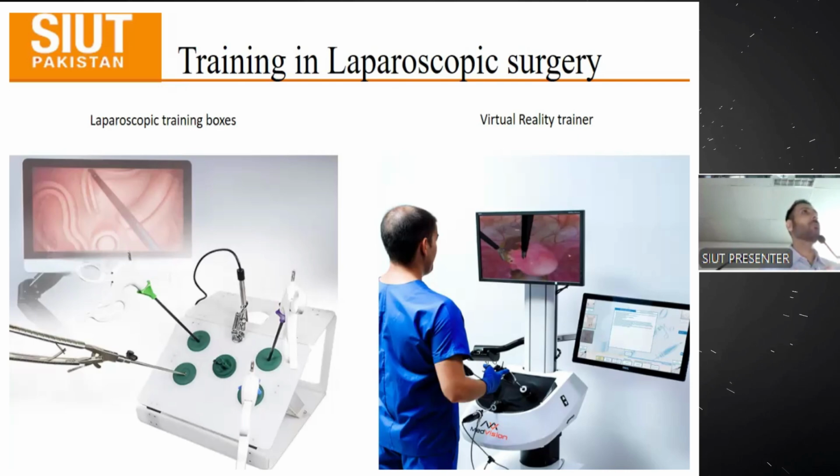So all of you who are in training or who want to become a laparoscopic surgeon in the future, or who are even training right now, should always use these laparoscopic box trainers and virtual reality trainers, complete your hours, and then go on to the actual patient.